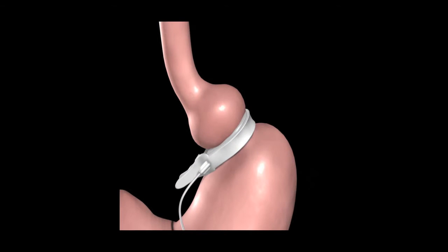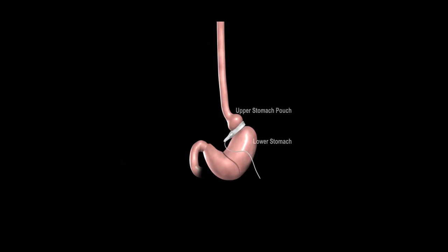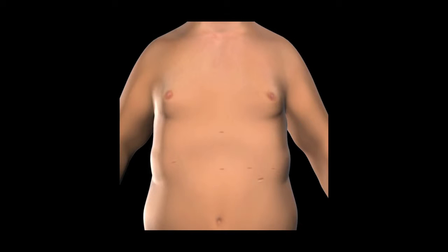A tube attached to the realize band will be connected to the injection port. The port is used to adjust the band tightness after surgery. An incision is made on the upper abdomen to insert the realize injection port beneath the skin. The tube is secured using the locking connector on the port. The injection port and tube are placed beneath the skin.